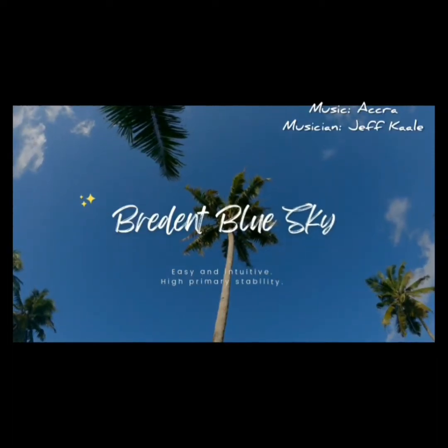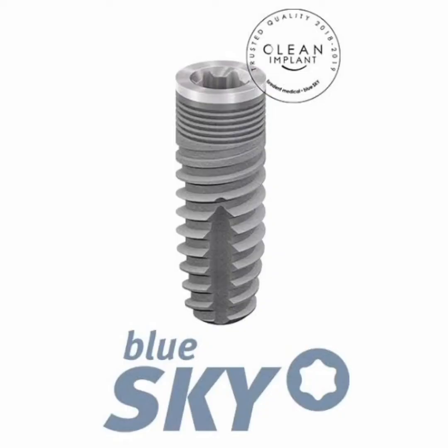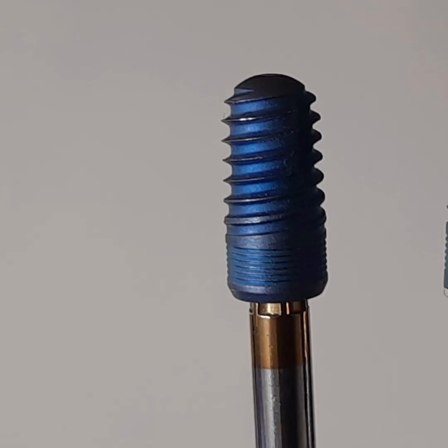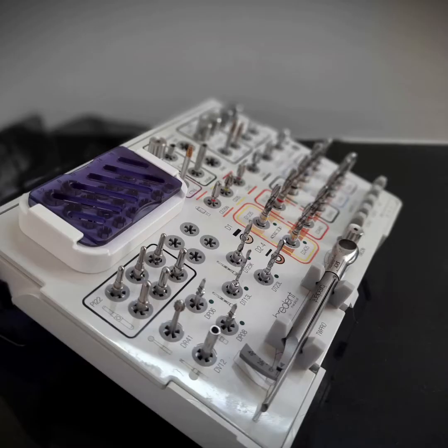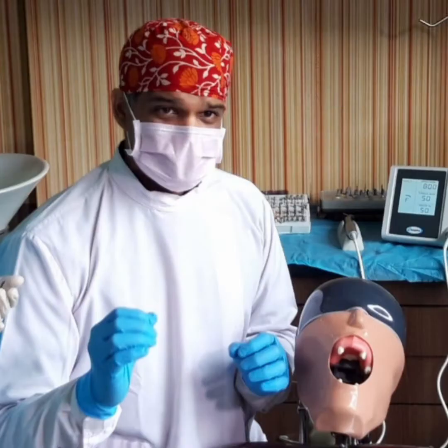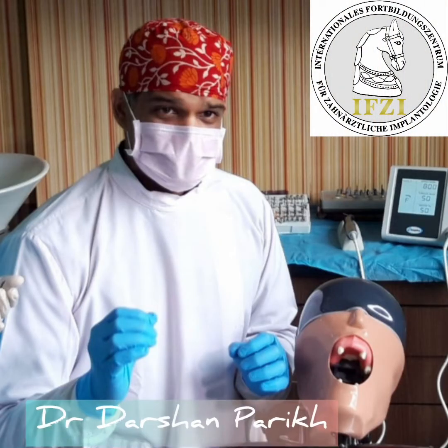Today, we focus on the surgical protocol for the Bredent Blue Sky and Narrow Sky implants. For this video, we chose a 4.5 by 10 mm fixture. I invite you to walk through the tray and components step by step with me, Dr. Darshan Parikh, an IFZI MasterCourse instructor. Let's begin.